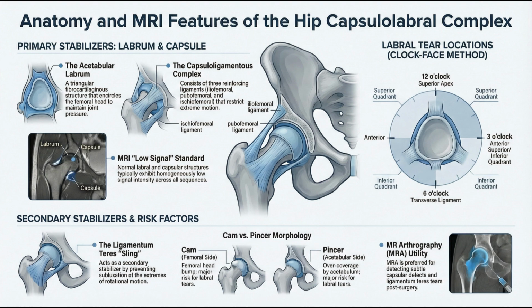They also mentioned a processing trick they use called radial reconstruction. This just sounded like pure geometry saving the day. It really is geometry at work. Think about a standard MRI. It slices the body in straight lines up, down, left, right. But the hip is a curve. It's a sphere. If you slice a sphere with straight lines, you get distortion at the curved edges. We call that partial volume effects. Which blurs the picture right at the rim where you need to see the labrum.